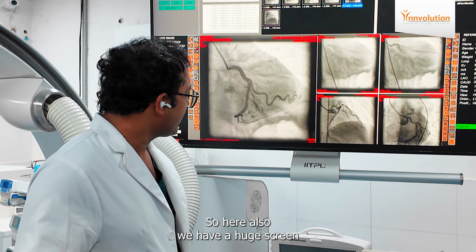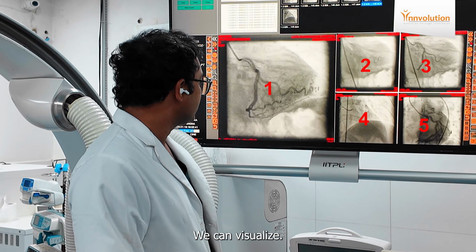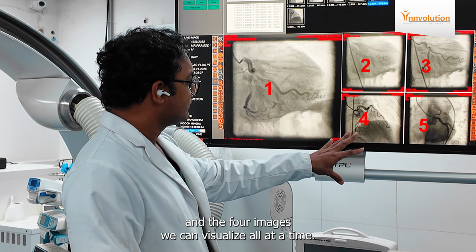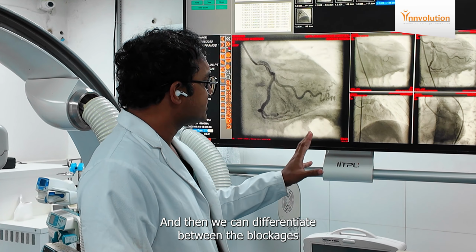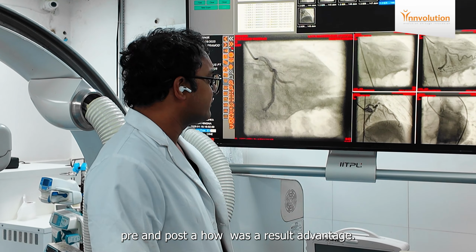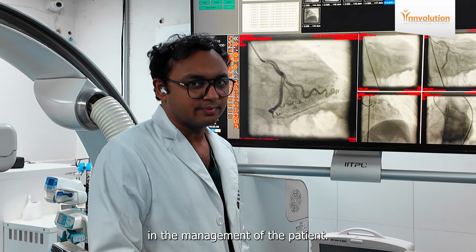Here we also have a huge screen where we can visualize the images, five images at a time. One is the bigger image and the four other images we can all visualize at a time, and then we can differentiate between the blockages pre and post, see how the result is, and that helps us take a better decision in the management of the patient.